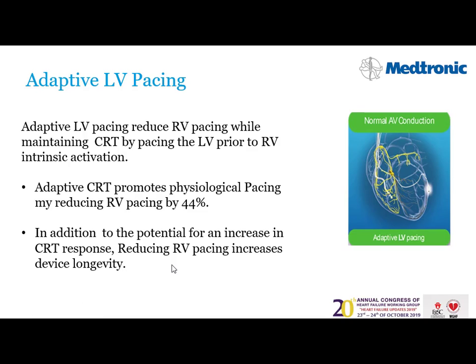One day I was implanting a patient, and after implantation it was on, and I saw a marvelous ECG. I did not fix anything, but as soon as the patient received the CRT firing, CRT optimization worked on, and I saw very good. But this same patient had atrial fibrillation a few days after, and the CRT, adaptive CRT, is gone because it does not work in AF. So I have to convert her to sinus rhythm and make it work again.